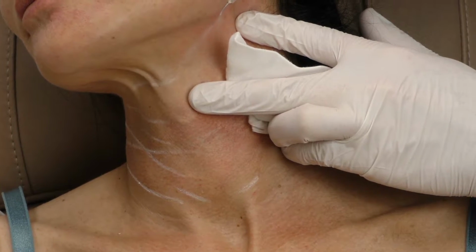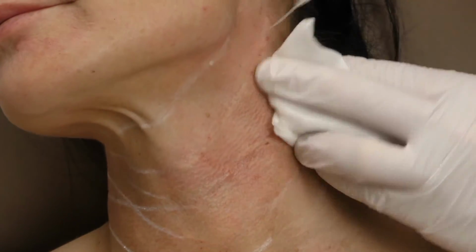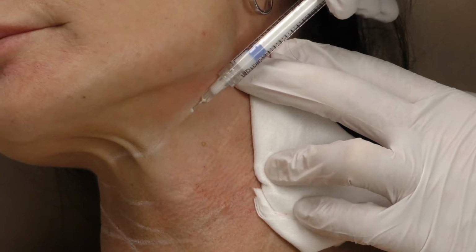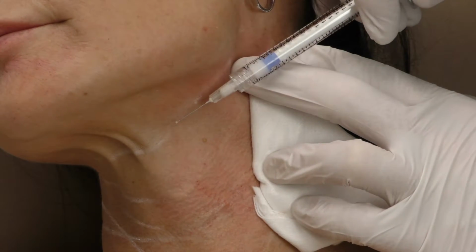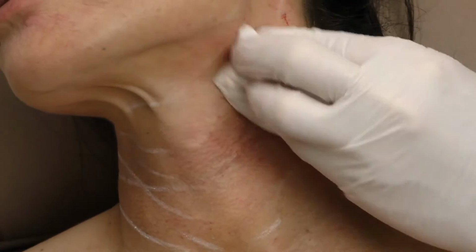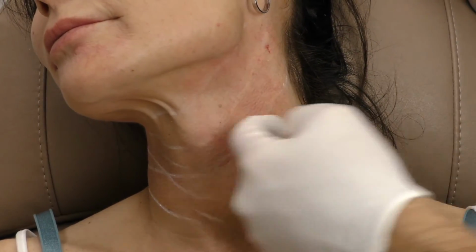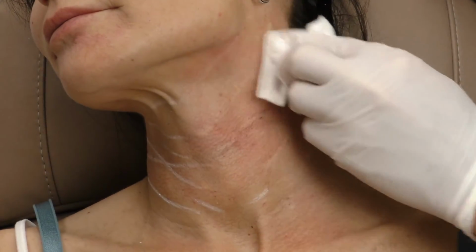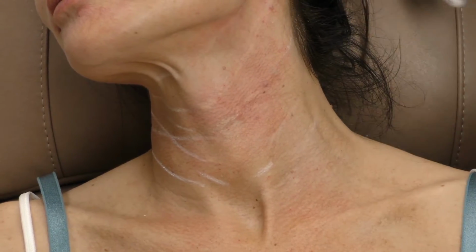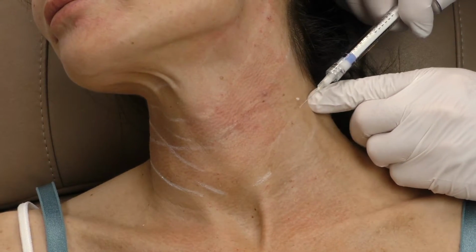Of course, the danger zones in the neck are the deep arteries, the common external and internal carotid artery, and superficially we have the jugular veins. So the jugular veins are usually like this, and those are the ones that can give you the big bruises. Of course, we're never going to reach the deep arteries with this technique because we have a very horizontal approach.